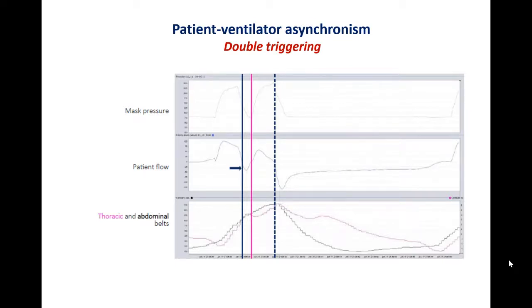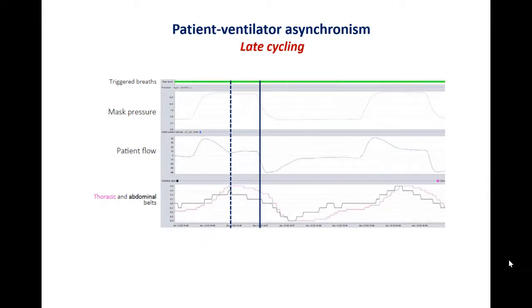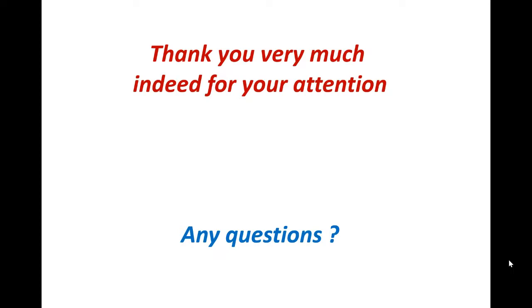pressure support. Late cycling: in this late cycling, the ventilator cycle is longer than the patient demand. And you have that. And also, again, Jean-Michel Arnal will explain this to you in detail. So that's what I wanted to share with you.